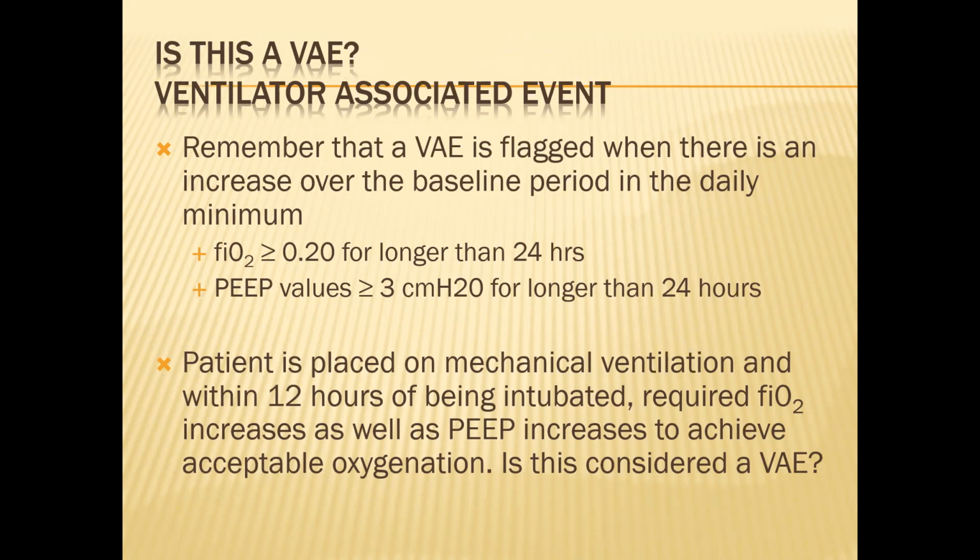Patient is placed on mechanical ventilation and within 12 hours of being intubated, required FiO2 increases as well as PEEP increases to achieve acceptable oxygenation. Is this considered a VAE? Well, it doesn't say how much FiO2.